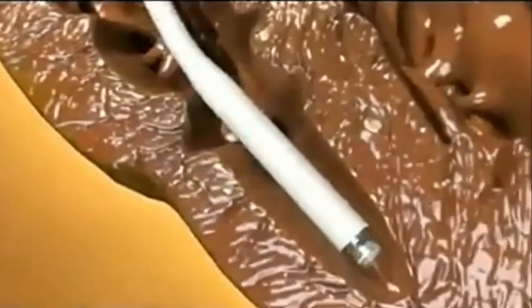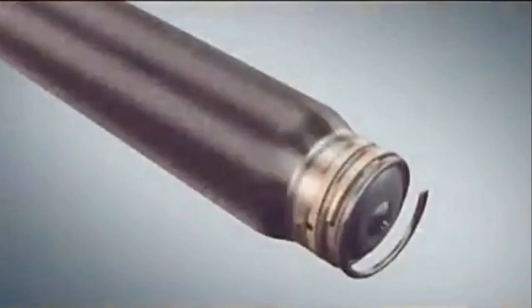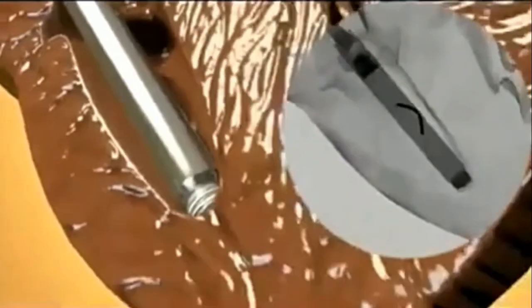The protective sheath is then drawn back and the pacemaker advanced until it makes contact with the right ventricular apical myocardium. A coiled spring on the distal end of the pacemaker makes fixation to the myocardium possible. The device is rotated through 1 and 1 quarter turns to screw it into the right ventricular myocardium.